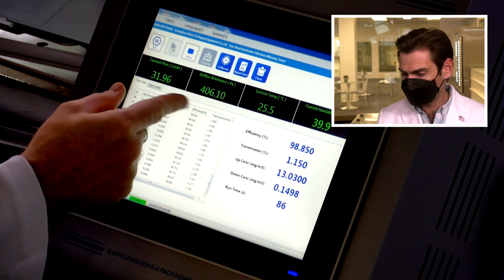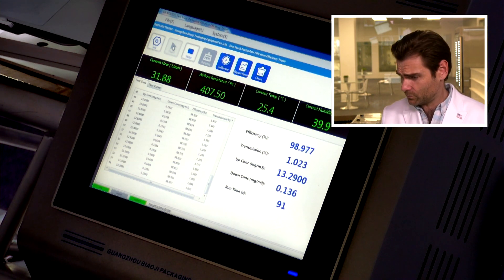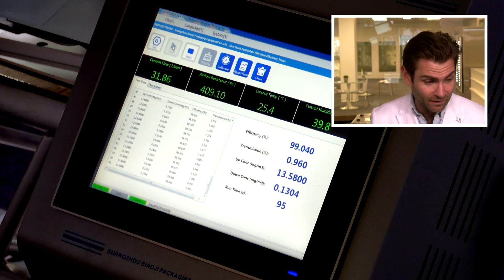It actually smells strongly of ammonium, but not so strongly that I have to take off the mask. You can hear how muffled my voice is. When I breathe in and out, I do feel like this airflow resistance reading is correct — this is not a very breathable mask. This is actually the second one I tested because I wasn't sure if the first result was correct. The efficiency is reading 99%.